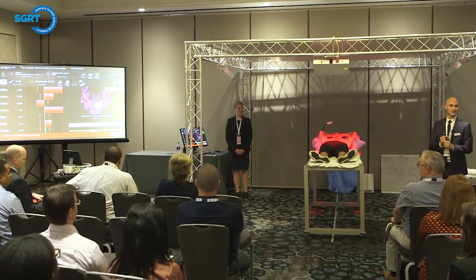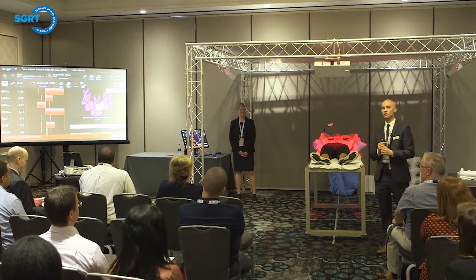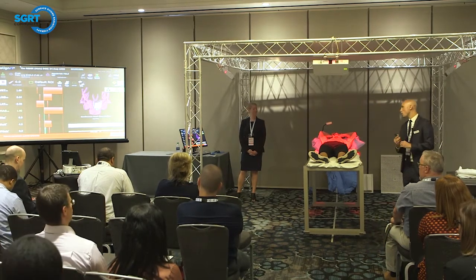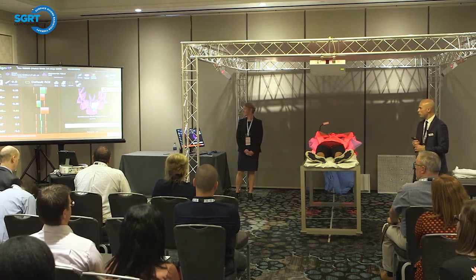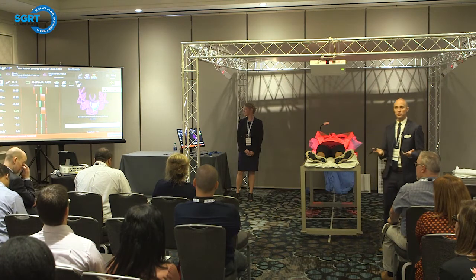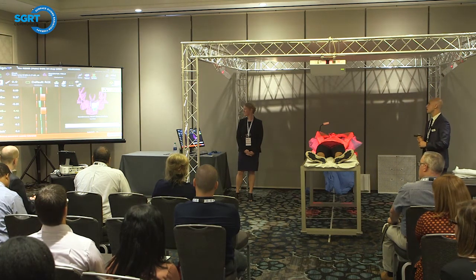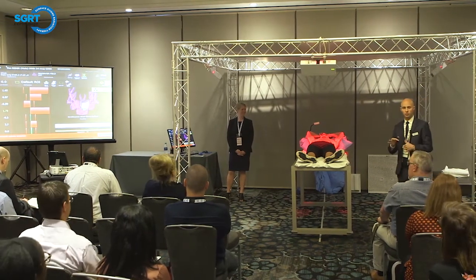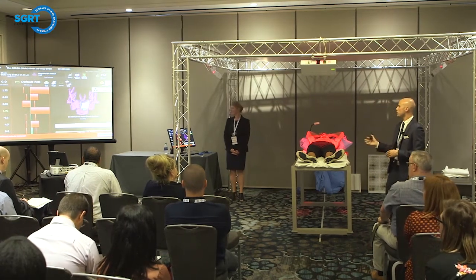Always monitoring, good job. Okay, so we're always continually monitoring our patient during treatment for intrafraction motion management. Okay, perfect. So we'll have our patient go ahead and take another breath in and hold it. And we're going to do this as many times as necessary until he has completed his treatment, okay? All right, good job. Okay, go ahead and breathe. So in that case, before we image, we would probably adjust his shifts, right, or his deltas. But again, I can't with this couch.